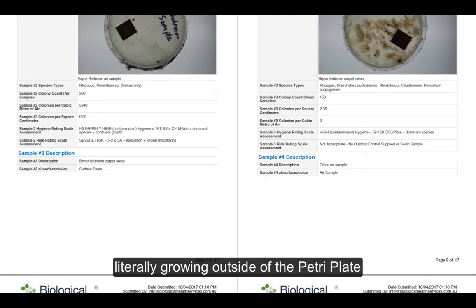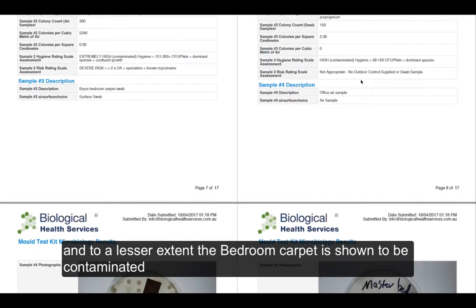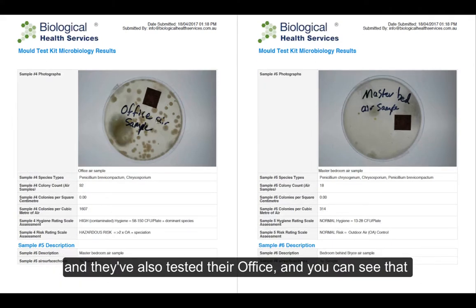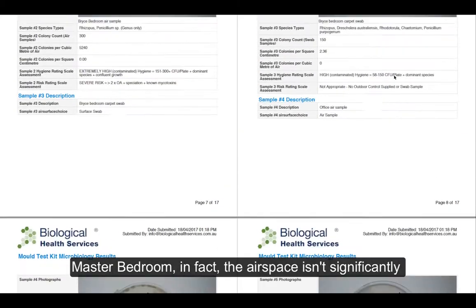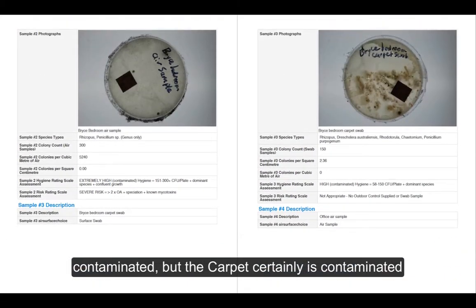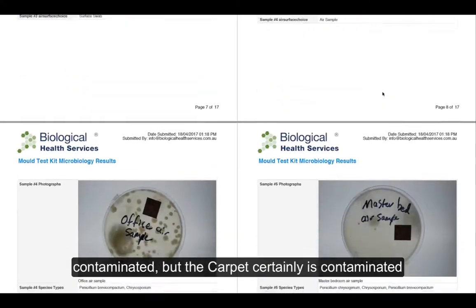To a lesser extent, the bedroom carpet is shown to be contaminated in this situation. They've also tested their office, and you can see that the master bedroom airspace isn't significantly contaminated, but the carpet certainly is.